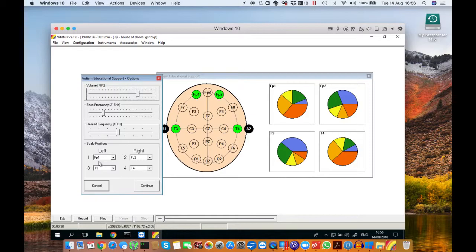You can adjust the base frequency which adjusts the tone of the sound that they're listening to, and the desired frequency. You can change this between 1 and 30. We've got it set to 16 because that's what trains relaxed attention.